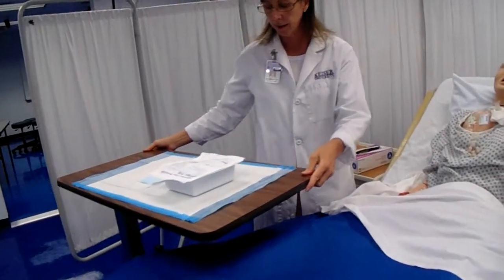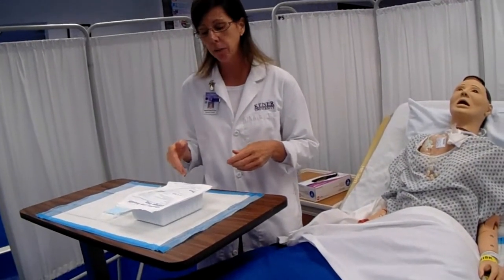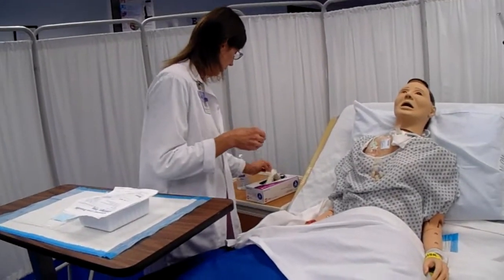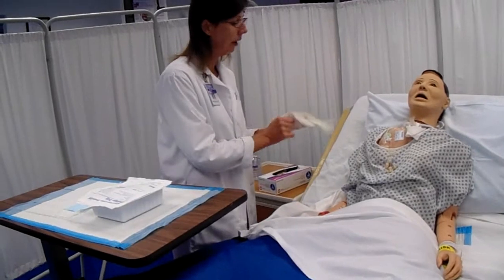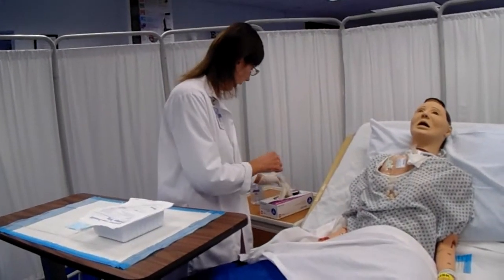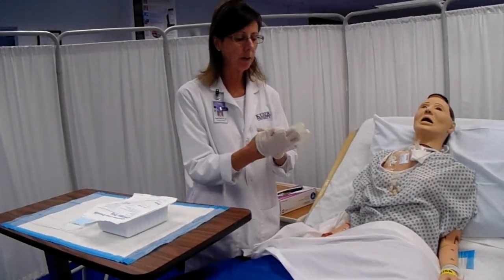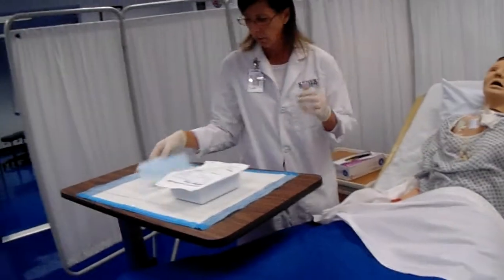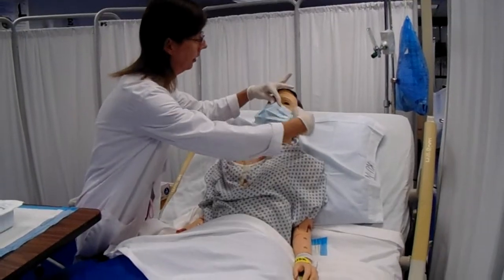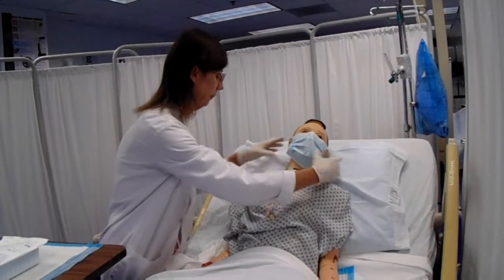Bring my supplies, which I have a central line dressing change kit with a bio patch inside and a mask for the client. Miss Cooper, I'm going to put a mask on your face, and I'm going to be wearing one too, so as not to accidentally contaminate the area underneath the dressing. So I'm going to put it on you and ask you to turn your head to the side as well. Is that okay, Mrs. Cooper? Patient verbalized understanding.